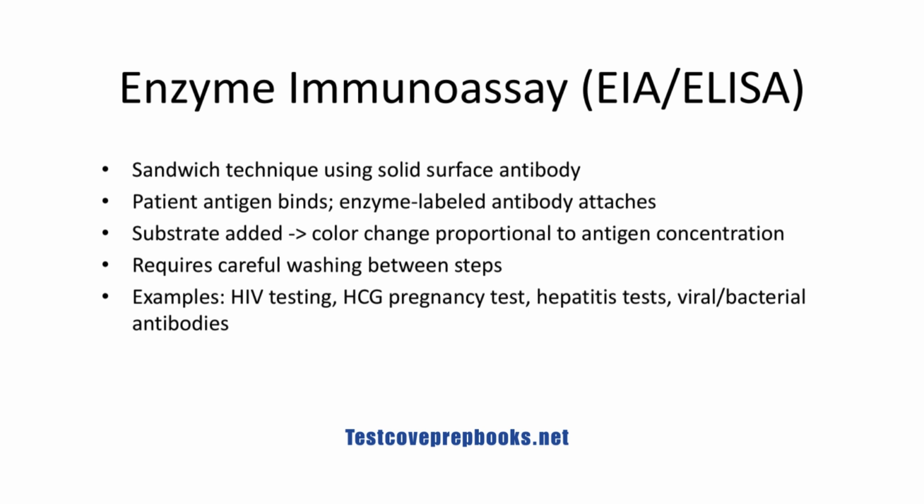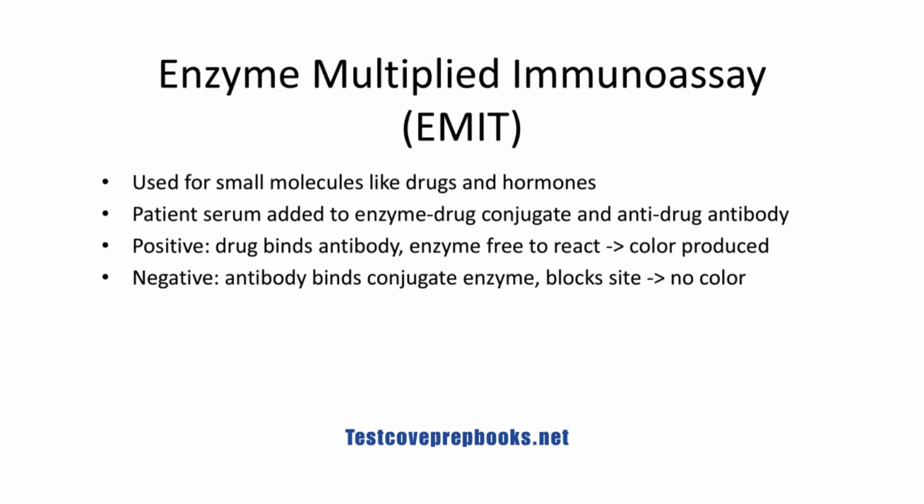Examples include HIV testing, pregnancy testing for HCG, hepatitis testing, and detection of viral or bacterial antibodies. Enzyme multiplied immunoassay technique, or EMIT. This technique is especially useful for measuring small molecules like drugs and hormones.